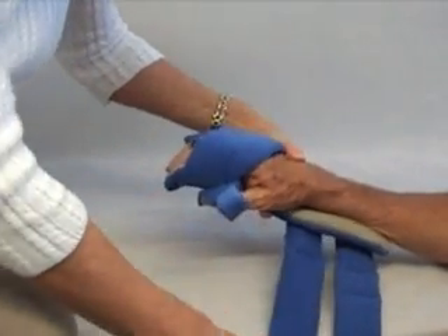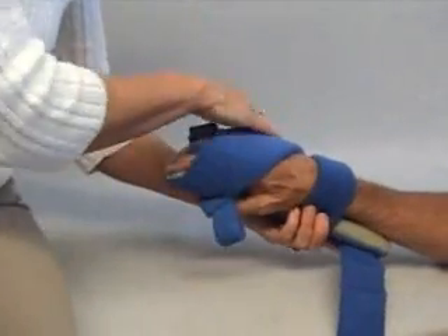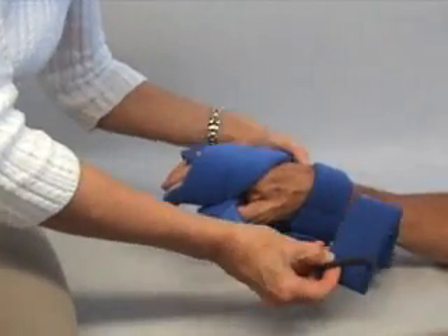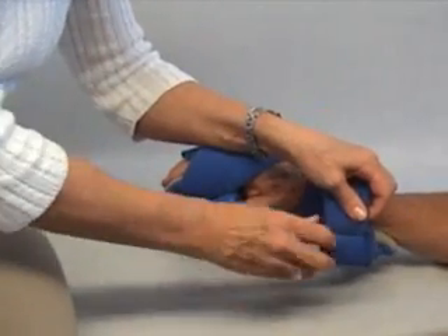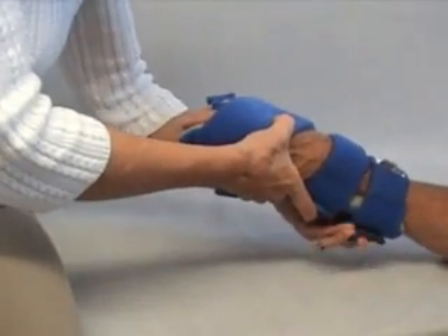Anchor that. Bring the wrist strap around, which also does a nice job of anchoring the back of the hand. If you'll notice, I've folded each piece of Velcro back on the strap, and that just makes it a lot easier to work with.